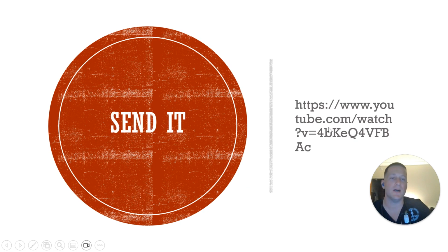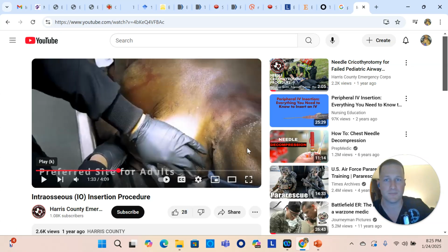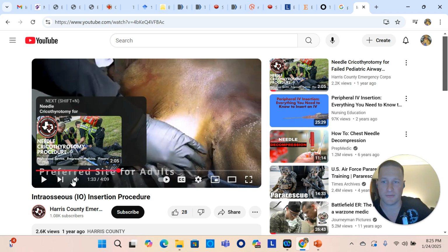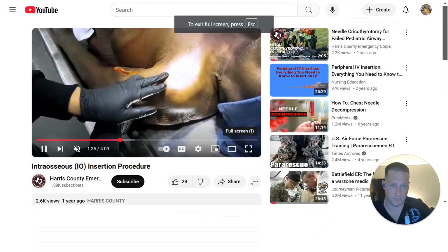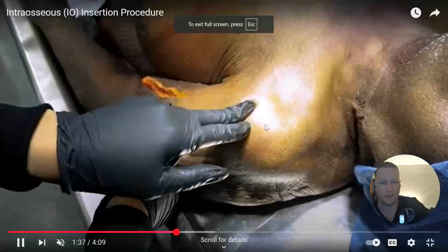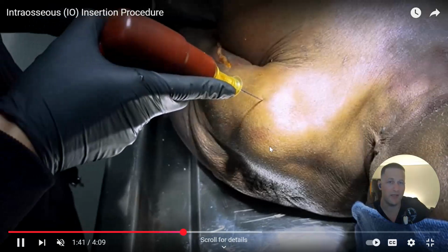Okay, we're going to go for it on this YouTube video real quick, and that will explain how the IO works. How to do one, basically. I'm just gonna talk over this thing. So basically, they're putting in a humeral IO here, and they're gonna find the greater tubercle of the humerus, and they're gonna put this IO down.